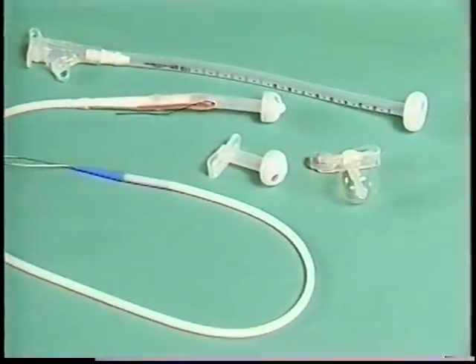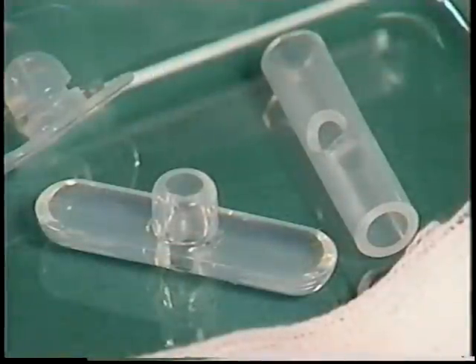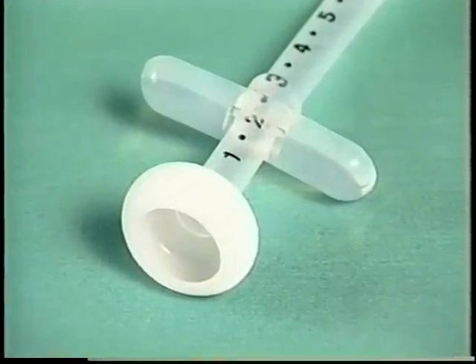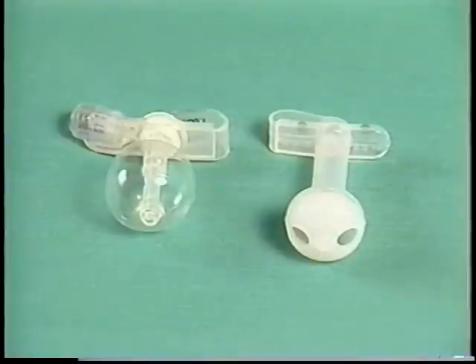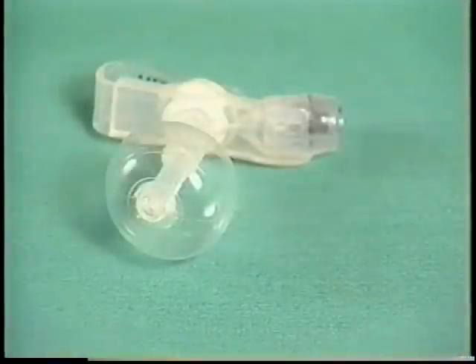All PEG tubes have internal bolsters to keep them from falling out and external bolsters to keep them from migrating inward. For an initial placement PEG, the internal bolster is typically a dome or mushroom-shaped structure attached to the distal end of the PEG. A replacement PEG has two different options for the internal bolster. The first option is the solid design, the same type as found with an initial placement PEG. The second option is the balloon-type bolster.